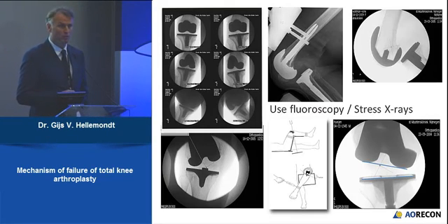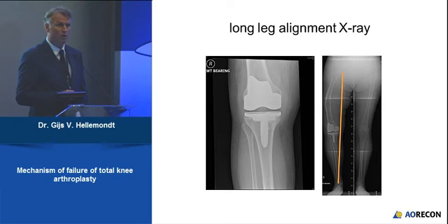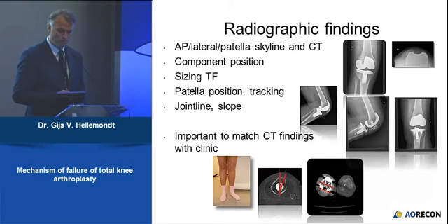And it can sometimes be very difficult to find in a clinical fashion. Secondary, it can lead to instability. Long-leg x-ray, we heard about it this morning in all painful total knee arthroplasty. If you look at this x-ray, it looks good. Unfortunately, if you make the long-standing x-ray, you see that this, unfortunately, is not a well-aligned knee, so remember that.